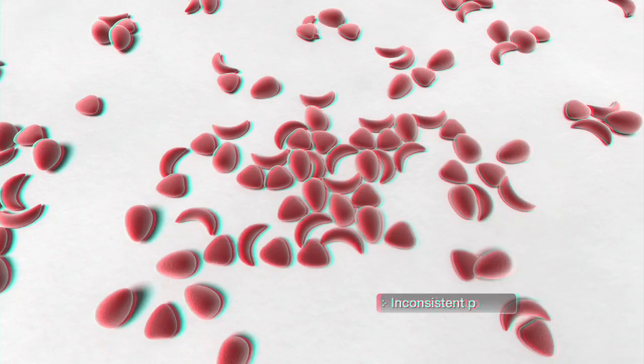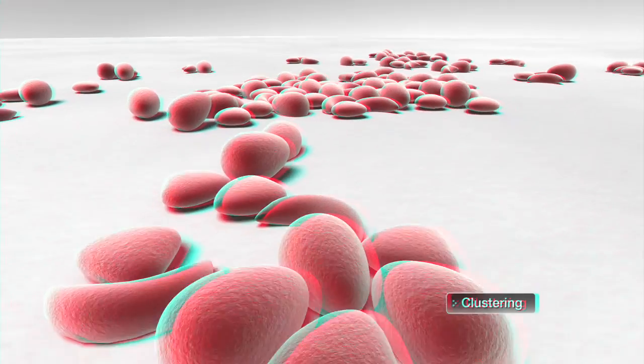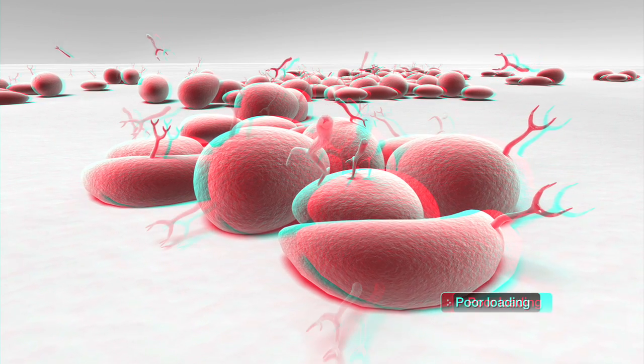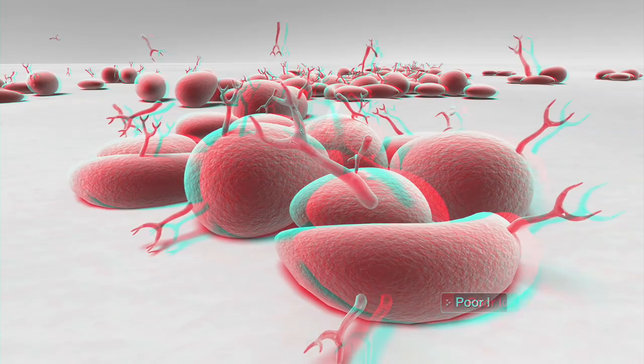Poor quality gold exhibits uneven sizes and shapes of particles and clustering. This leads to uneven surface area and inconsistent loading of proteins.